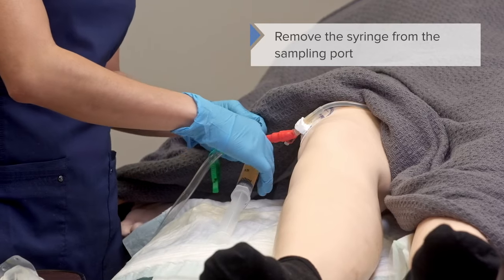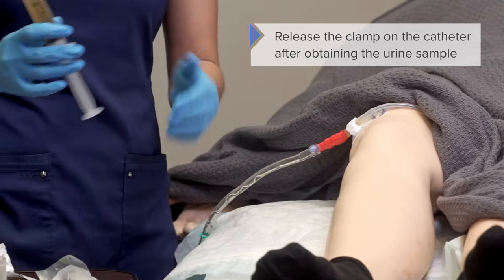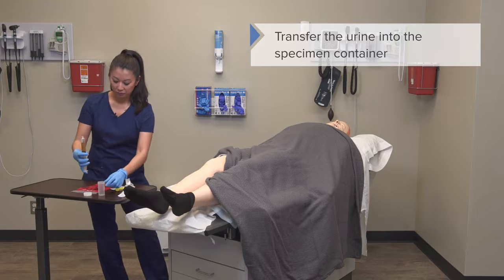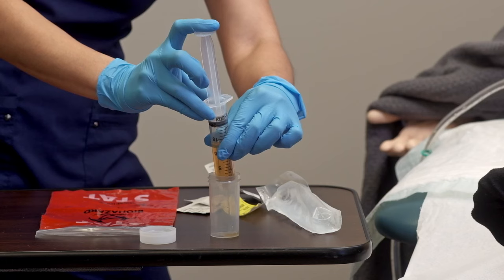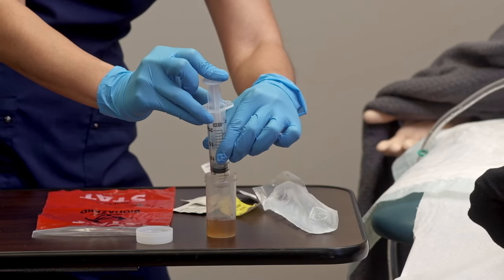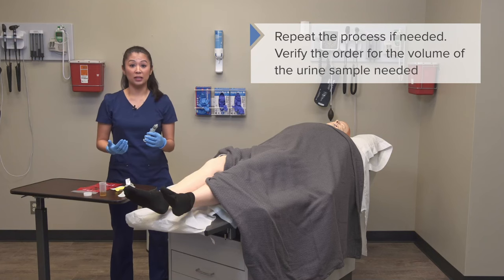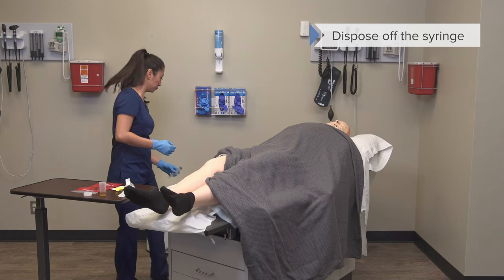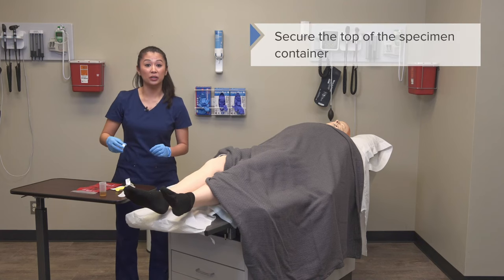Once I've done this, I can remove the syringe from the sampling port, then I'm going to transfer this into the specimen container. You may need a certain amount, so you would just repeat the process. Once I'm done, I'm going to go ahead and dispose of this syringe. Then I'm going to take my container and make sure I secure the lid.